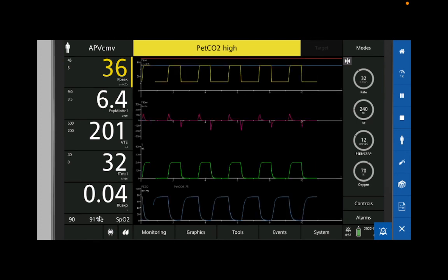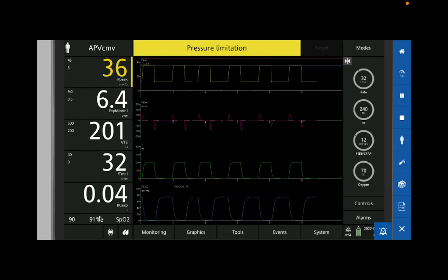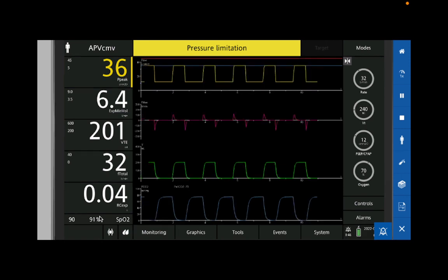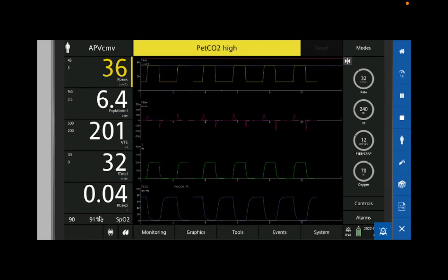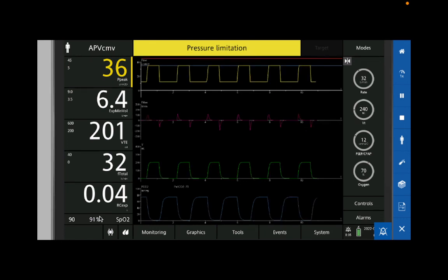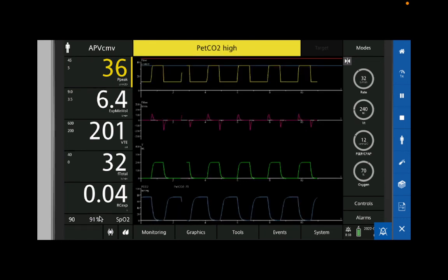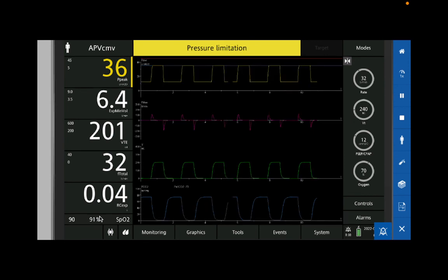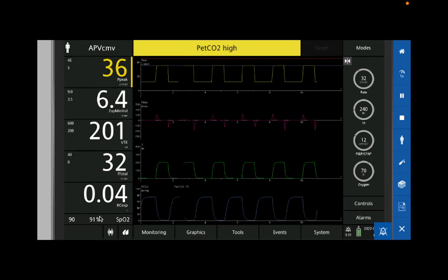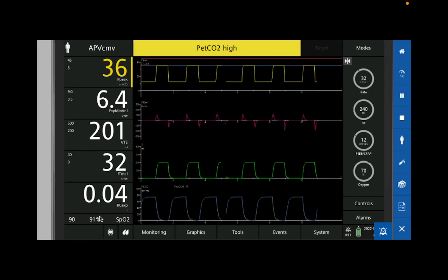Okay? So this morning on medicine, as we were rounding, my patient was desatting. So we turned him up to 100%, and we said, why? And that's fine to do as you're thinking, right? You know what? This patient has neuromuscular disorder. He doesn't have a great cough. We suctioned him, and we pulled out all these lovely boogers. And his sats came back up to 100, and I could take my FiO2 right back to where it was before. He was full of secretions. Literally, he just had a pile sitting at the base of his tube. It was lovely. I have a weird opinion of lovely, I know. So it's just good to get that stuff out.